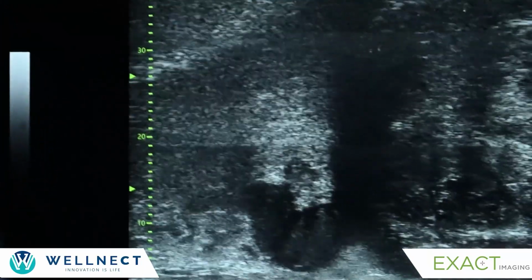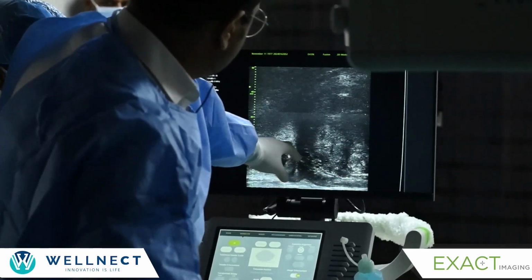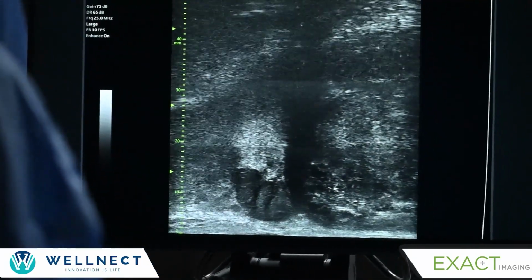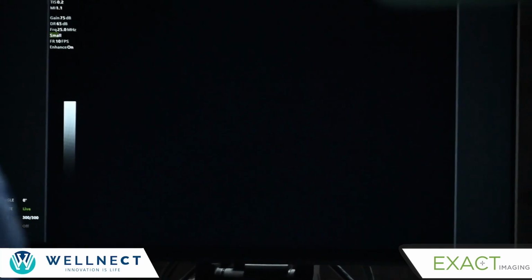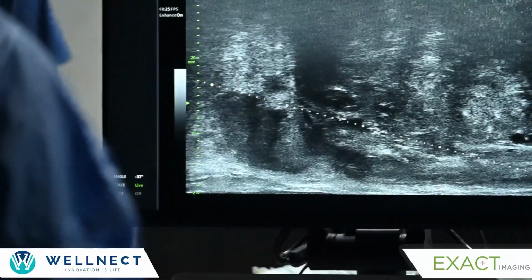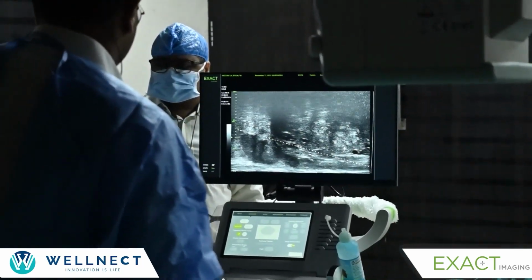Now, as a procedure, we instill local anesthesia. This is the place between the prostate and the seminal vesicle. This is where your neurovascular bundle would be. Now, there are 2 types of guide. As you can see, this is the first guide, which is for anesthesia. And you see, this is the area where I have to target. Now, this is an IP needle that I would be inserting through it, and then I would instill.